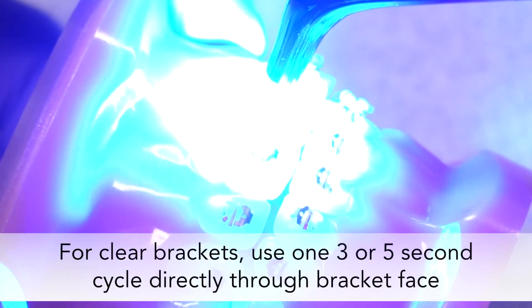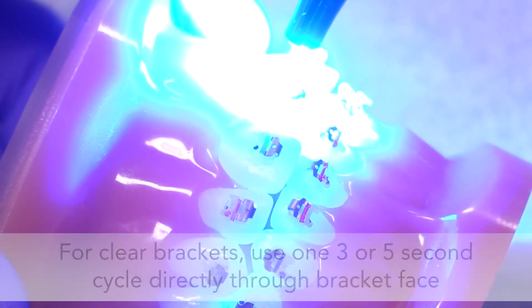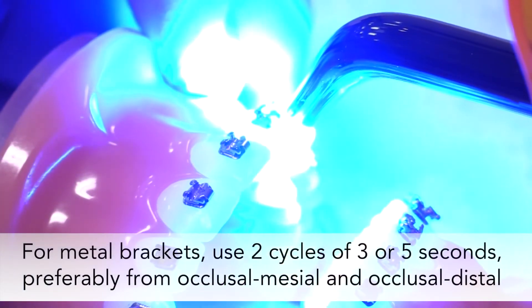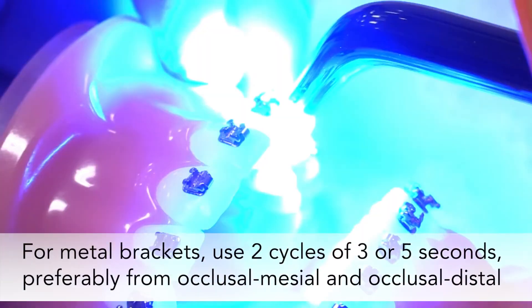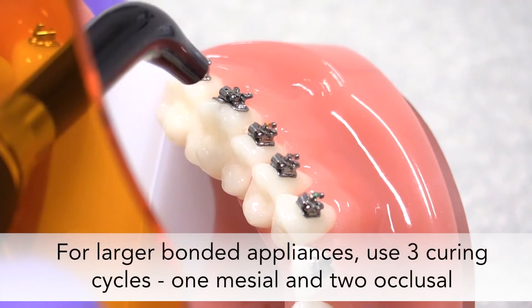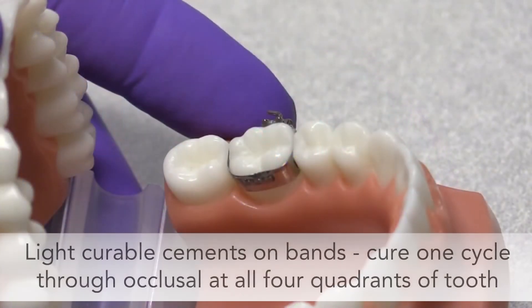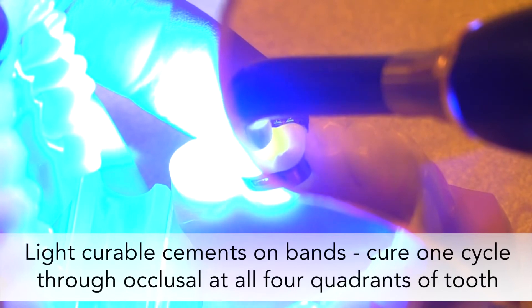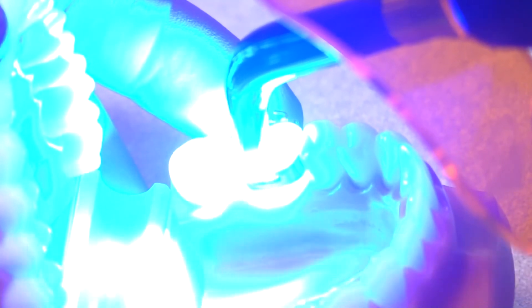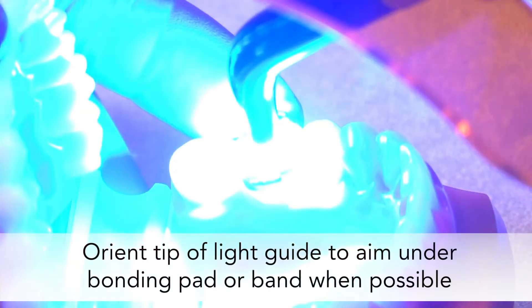When curing clear brackets, we recommend one curing cycle of 3 or 5 seconds directly through the face of each bracket. For metal brackets, we recommend two cycles of 3 or 5 seconds each, preferably from occlusal mesial and occlusal distal. With larger bonded appliances like direct bond tubes, we recommend three curing cycles — one mesial and two distal. For light-curable cements on bands, cure one cycle each through the occlusal at all four quadrants of the tooth. Always orient the tip of the light guide under the bonding pad or band whenever possible.